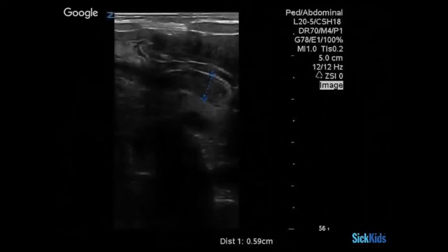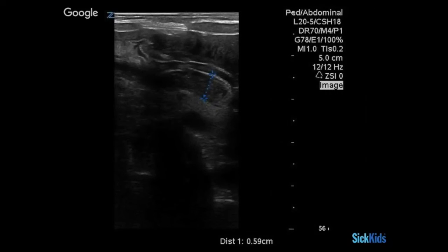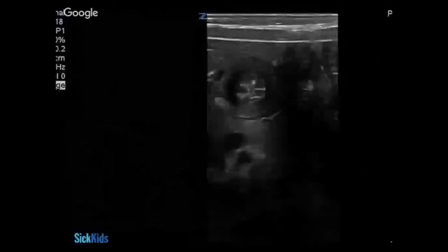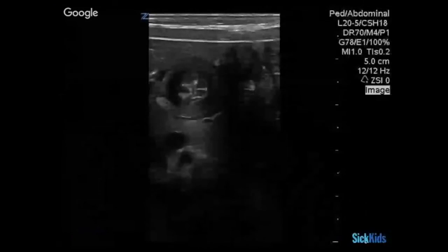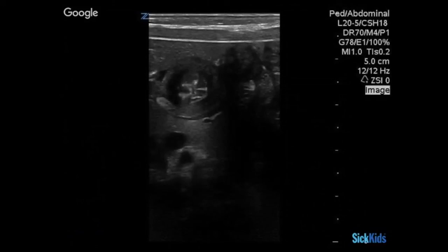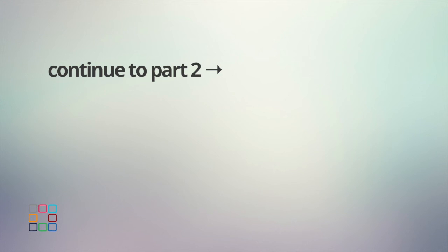Here's another measurement of muscle wall thickness. When measuring a structure that's a cylinder, to be most conservative we typically want to measure at its narrowest point, because measuring at the thickest point could introduce error based on the properties of a cylinder. Here you can see the measurement is well beyond what we would expect. There's also the consideration of measuring in the transverse plane for muscle wall thickness if you're having some difficulty.